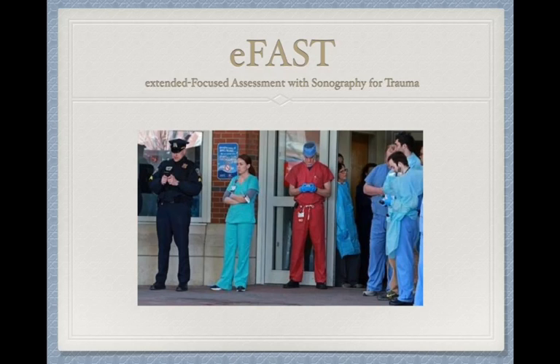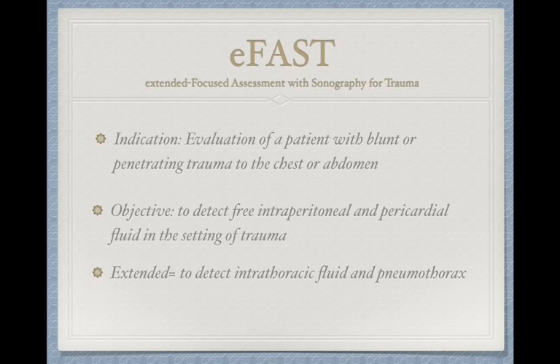So eFAST stands for the Extended Focus Assessment with Sonography for Trauma. We're basically going to be doing this exam when we're evaluating patients with blunt or penetrating trauma to the chest or the abdomen. The objective is to detect free intraperitoneal or pericardial fluid in the setting of trauma. The extended piece was added a little bit after the FAST was first described, and that was to reinforce the fact that we're also looking up in the chest cavity for intrathoracic fluid and pneumothorax.